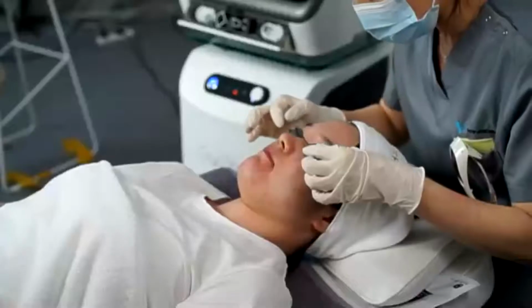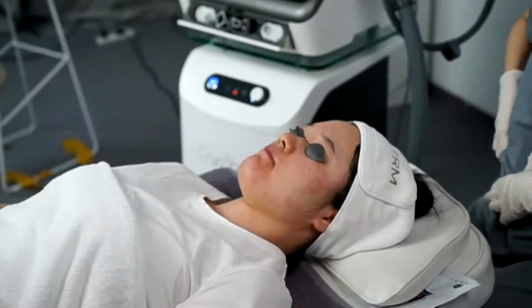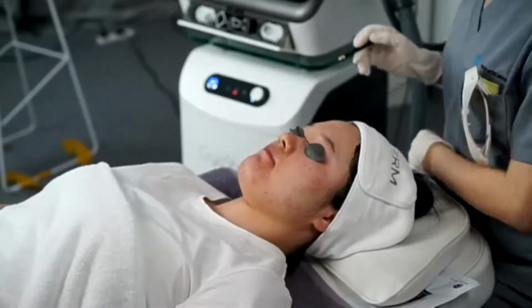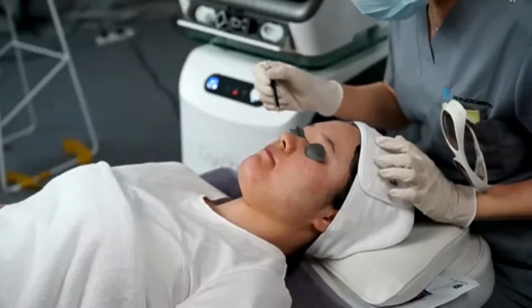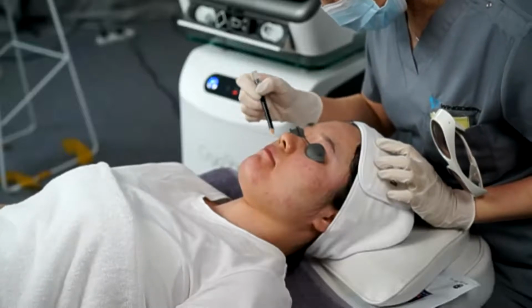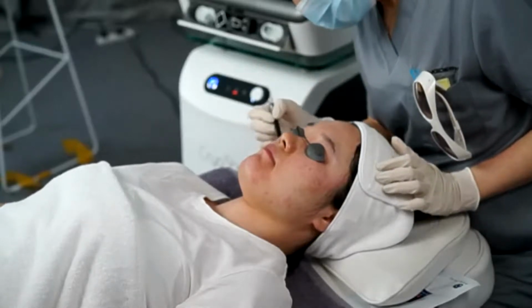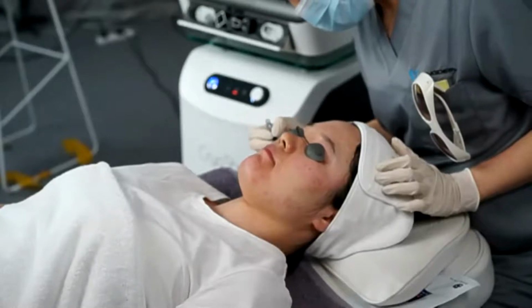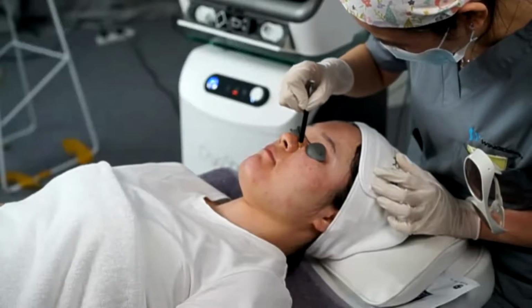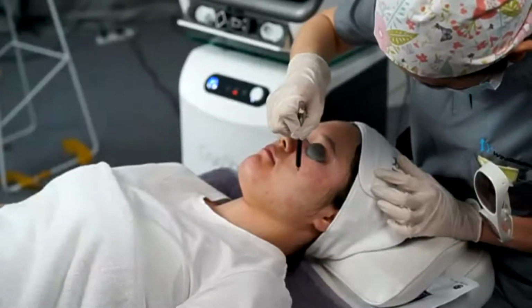Okay, she has already finished the surface cleaning, and then we first mark the key areas of the face. We will use the mark pen to mark the most serious parts on her cheeks. Her cheeks have 2 parts where the pores are very large. And another 2 parts where the acne scars are very serious.